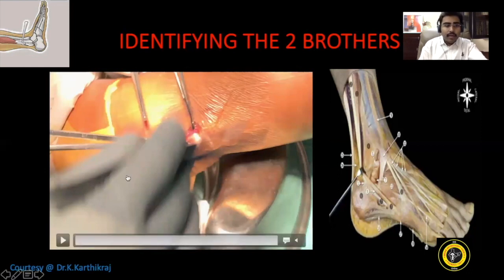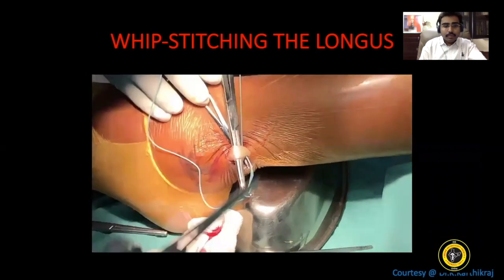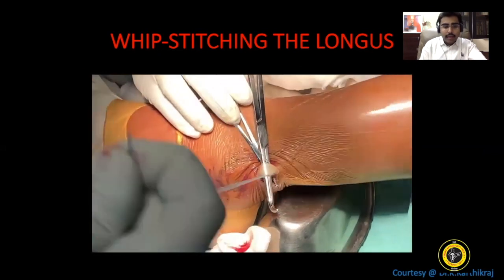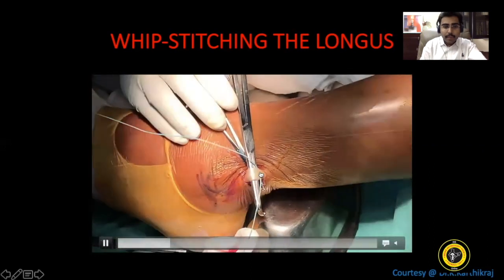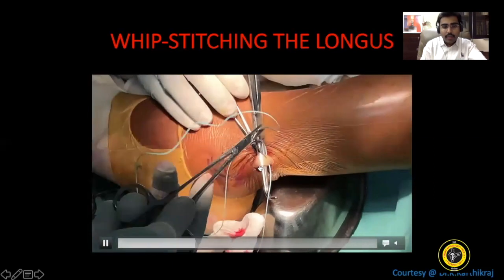This can be done through a very small incision. Once it is done, the next step is taking whip stitches on the longus. Now you could see me utilizing two right angle arteries. The larger one is having the longus clinged on, and the smaller one is below the peroneus brevis. Now, I would tell you the reason why I'm doing that.